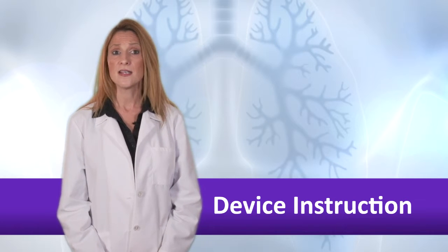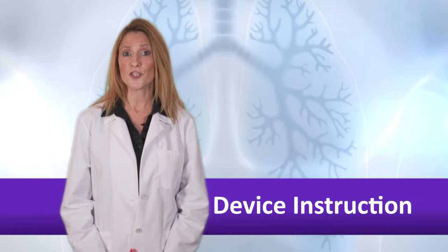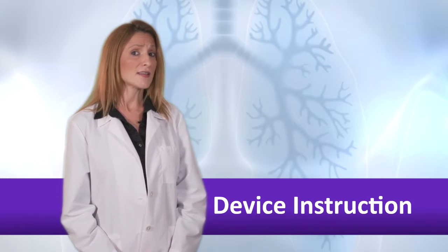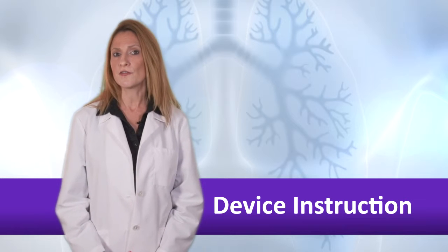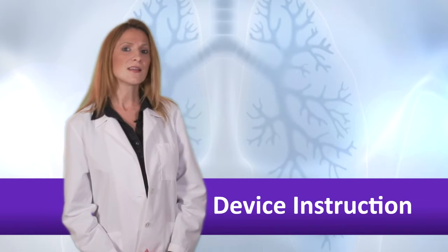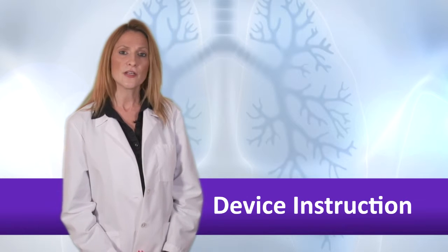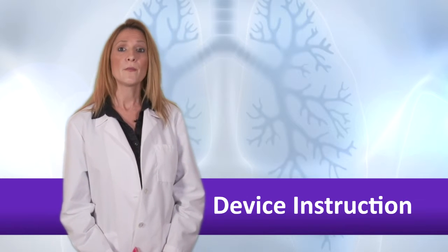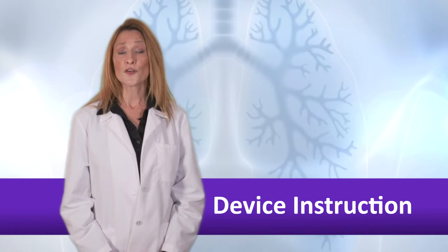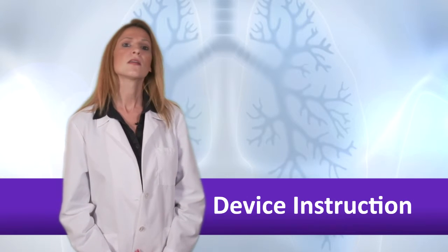On the other hand, if this is a new device but the patient had used a similar device before, you might point out the similarities and differences of the new device to the previous one. This portion of the counseling could sound like this: This device is very similar to the one you were using, but there are some important differences that I want to point out to ensure the best results.